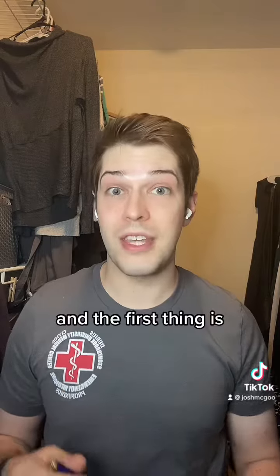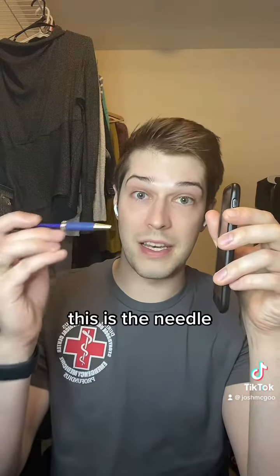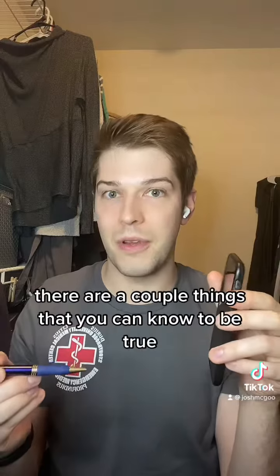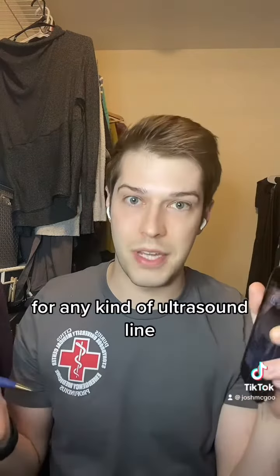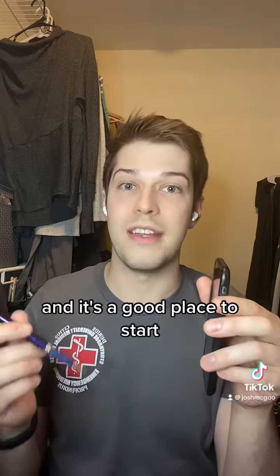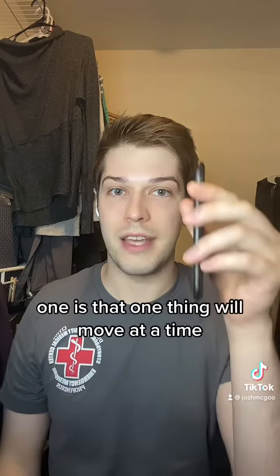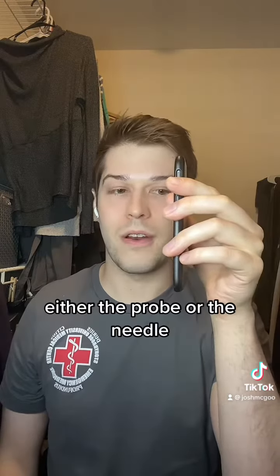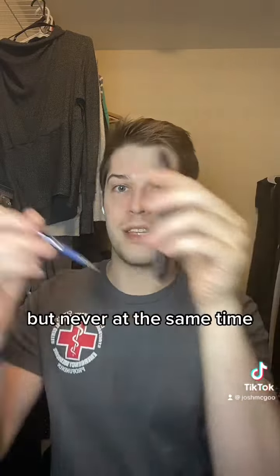The first thing: this is my ultrasound probe, this is the needle. One thing will move at a time — either the probe or the needle, but never at the same time.